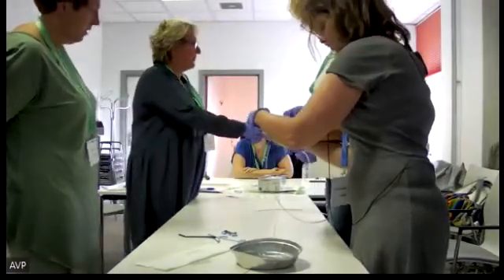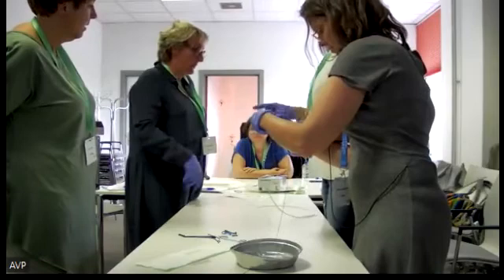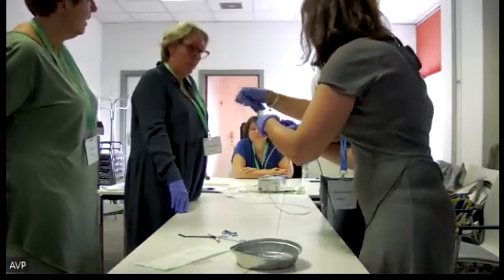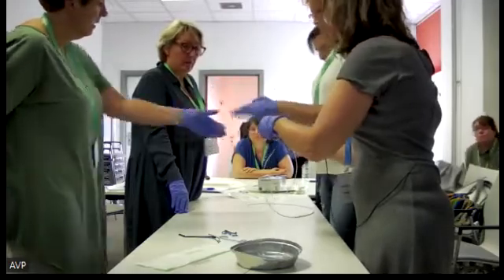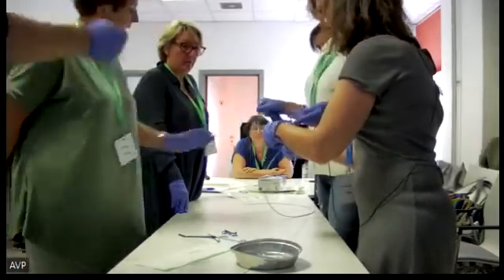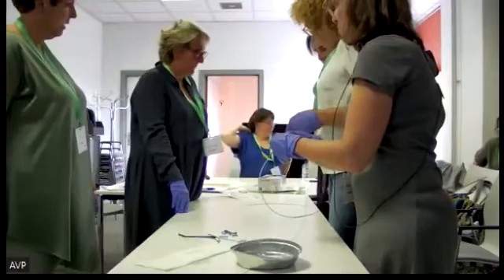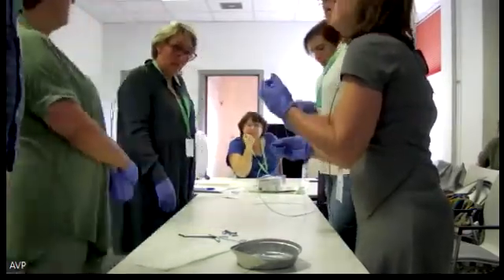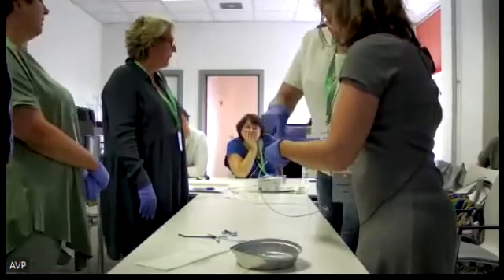See, the stylet here is really flexible. So it doesn't help. If you want to give a bit of rigidity, you can push the end of the wire here, the end of the wire, just for rigidity, up to the hole here.